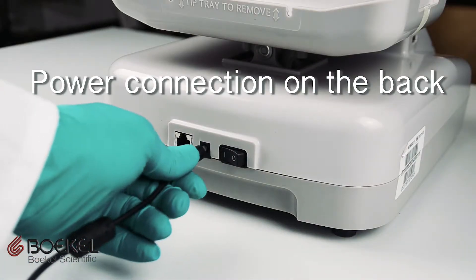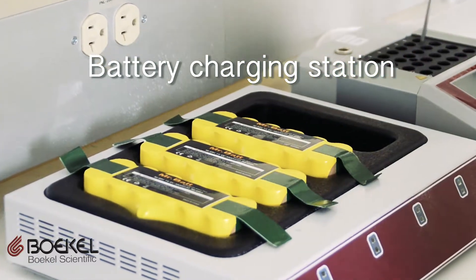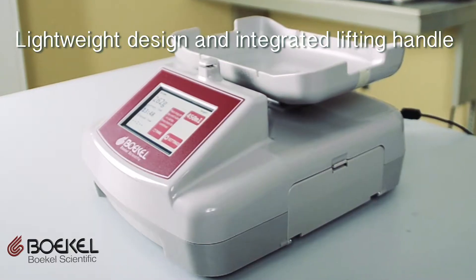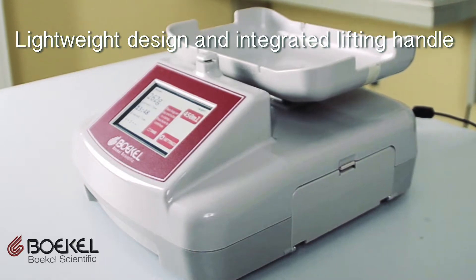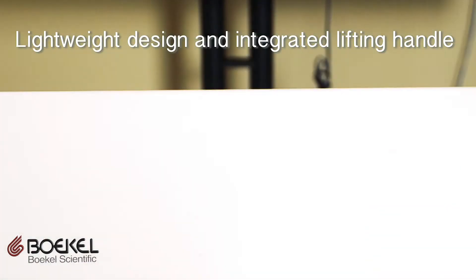The unit is supplied with a long-life removable battery that can last up to 20 hours. The battery charges when the unit is plugged in or with the optional four-position battery charging station. It is also incredibly easy to transport thanks to its lightweight design and integrated lifting handle.